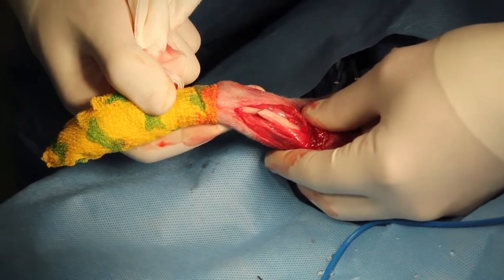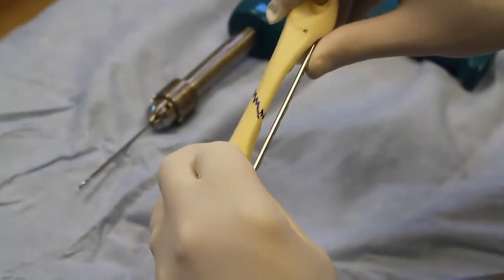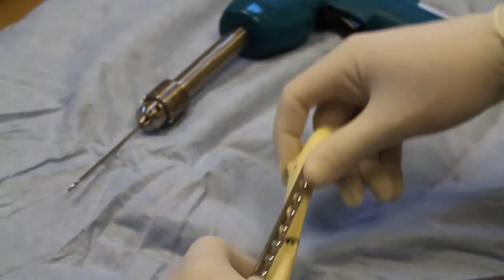Here at the Balson Spa Veterinary Clinic, Dr. Anderson, who has had extensive training in orthopedic surgery, generally prefers bone plating as the preferred method of fracture repair.